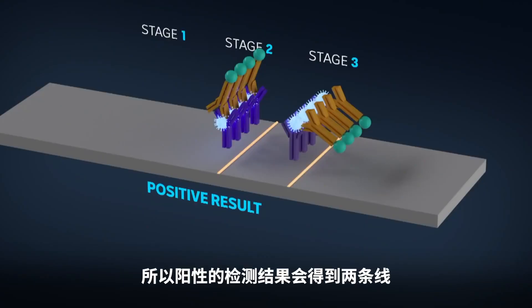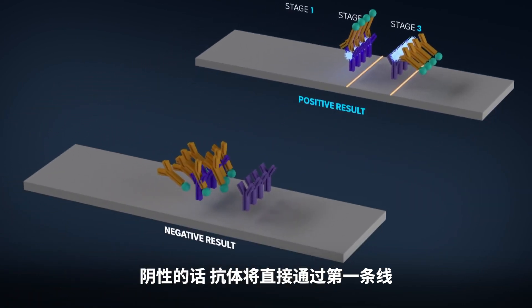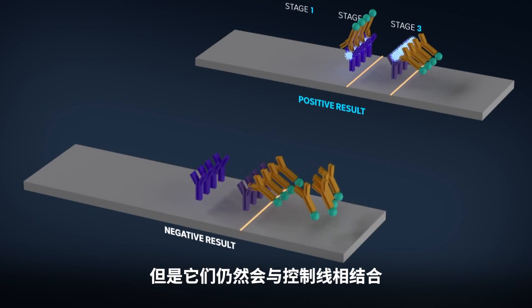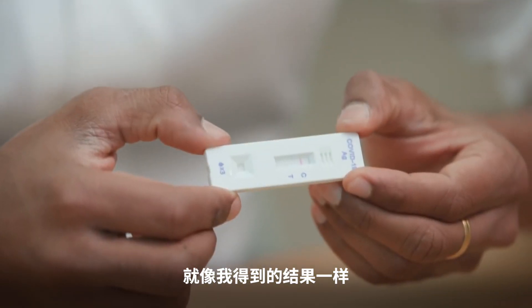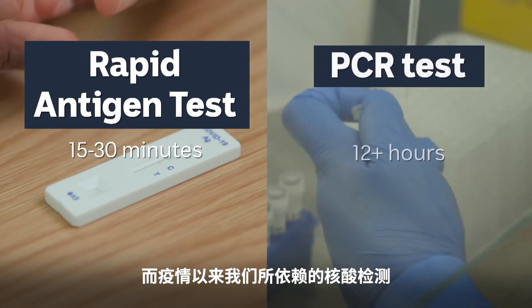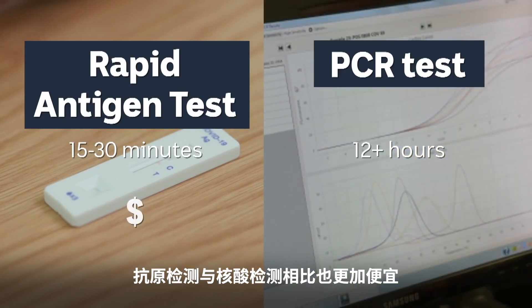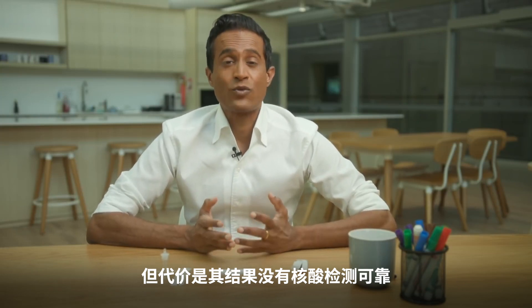A positive test shows up as two lines. For a negative test, the antibodies will move straight past the first line because there's no virus to bind them together, but they will still bind to the control line — meaning a negative test will be displayed by just a single line. The test takes about 15 to 30 minutes, compared to hours if not days for the PCR test. The antigen test is also relatively cheap compared to the PCR, but the trade-off is it's less reliable.